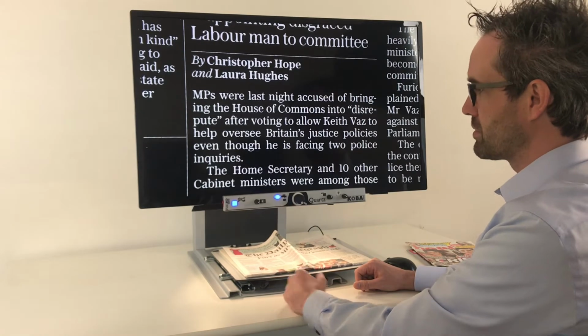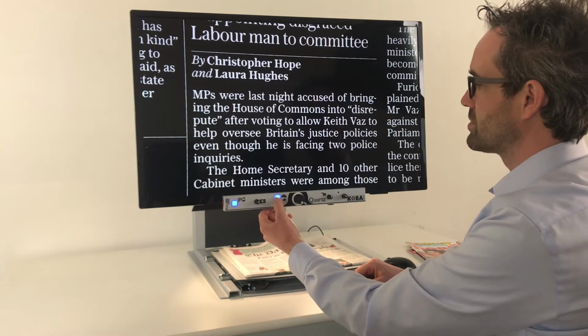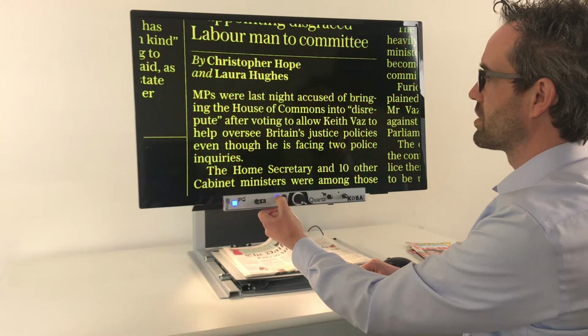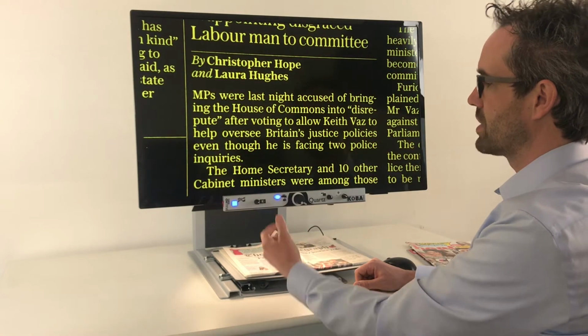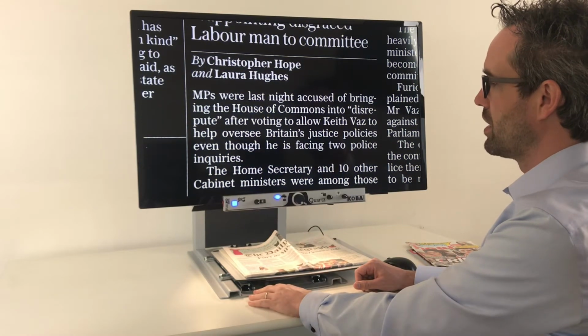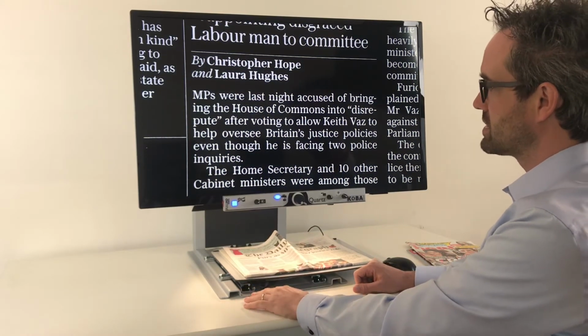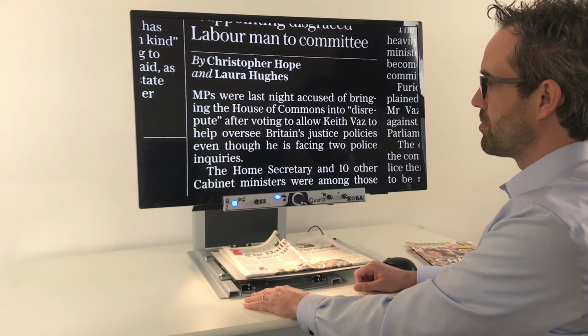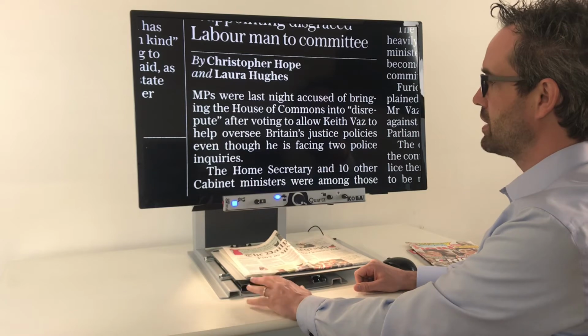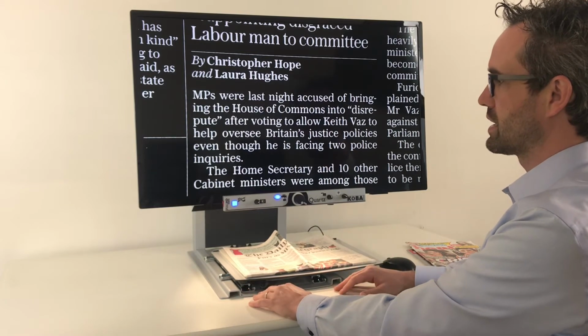You also have the possibility to change to different colors as well. So if you press long, you can select green, the color that you want. Yellow. If you press again, you will see it will go back to black and white. By default, the unit has six different colors, but you can add up the colors to 28 if you want. It's in the hidden menu and we can select the colors that are necessary.